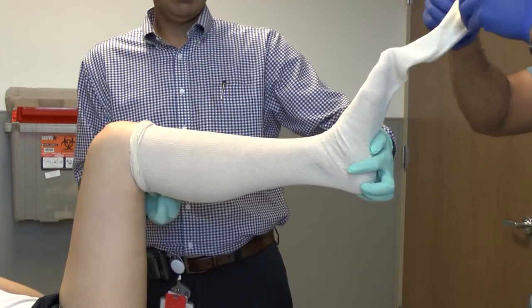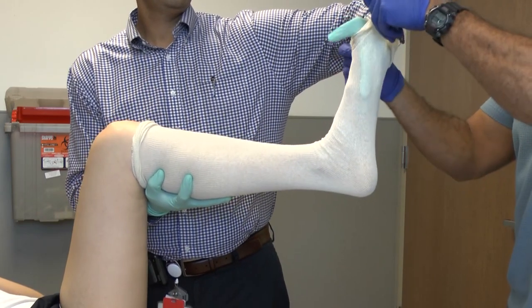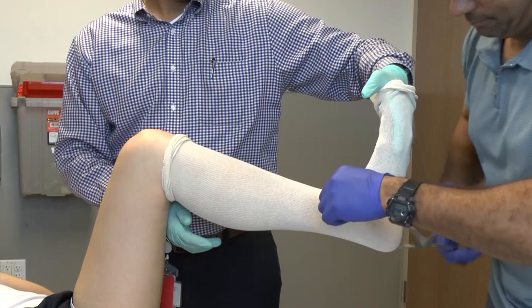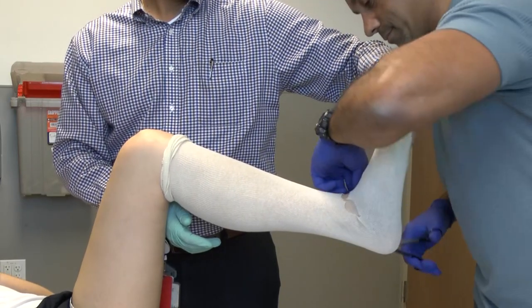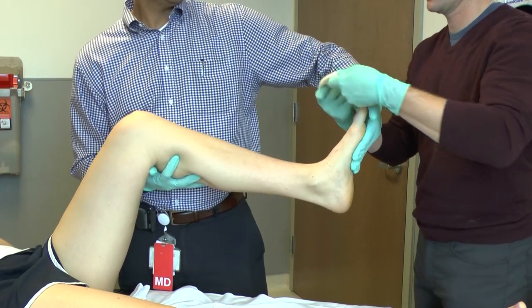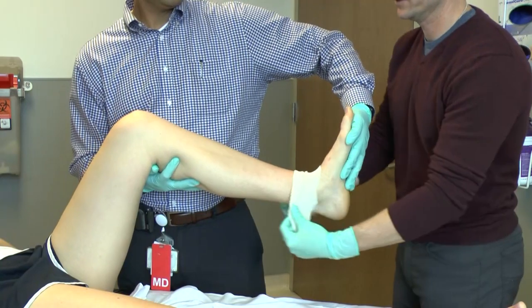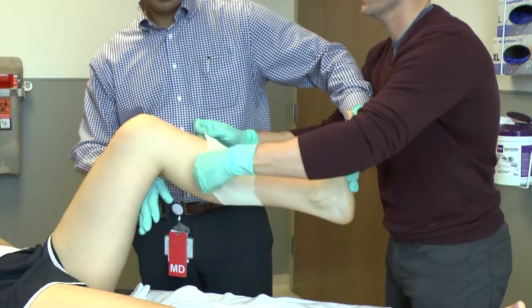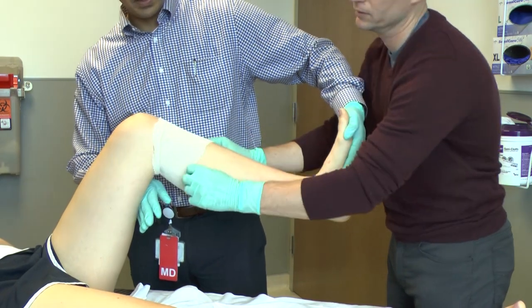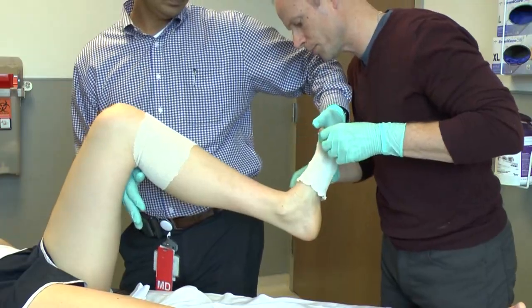There are two methods to placing the stockinette. The first is placing a full-length stockinette, which requires cutting out the anterior aspect at the ankle so as not to achieve any wrinkles underneath the cast. The second method is to place it in a more segmental fashion. The advantage of the segmental approach is that if you're worried about compartment syndrome, you have to do less cutting close to the skin, though it is more fussy in application.